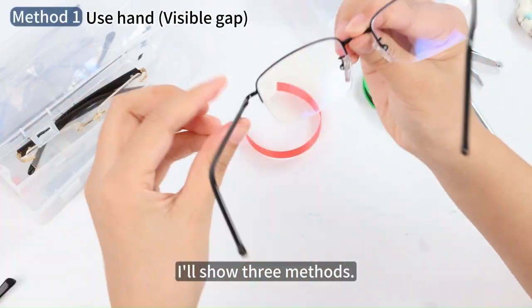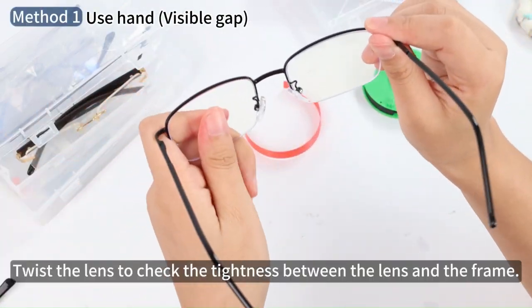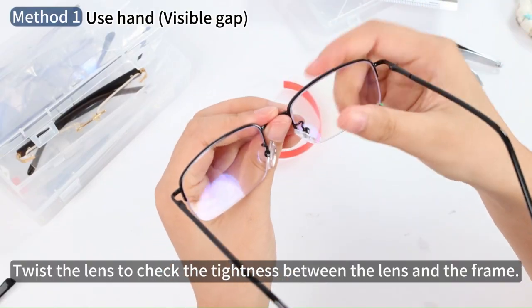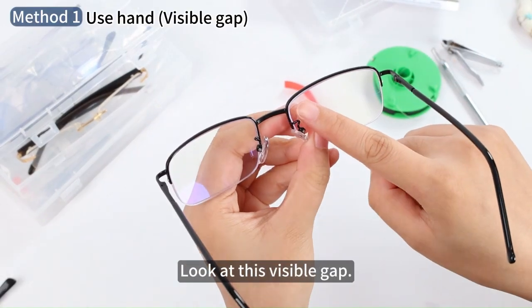I'll show three methods. Twist the lens to check the tightness between the lens and the frame. Look at this visible gap.